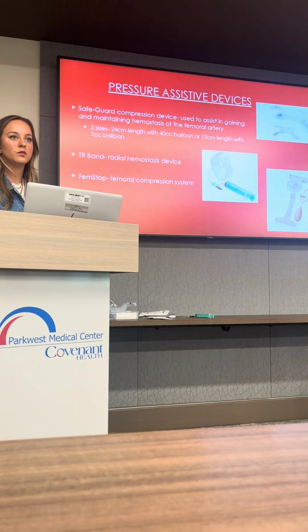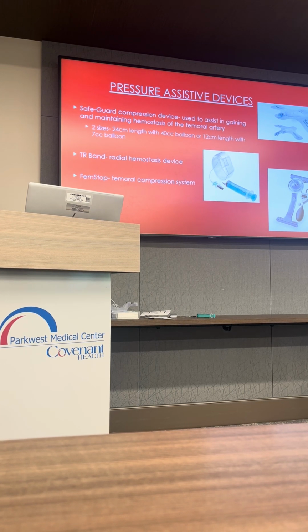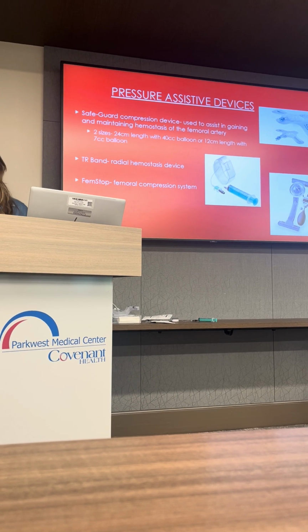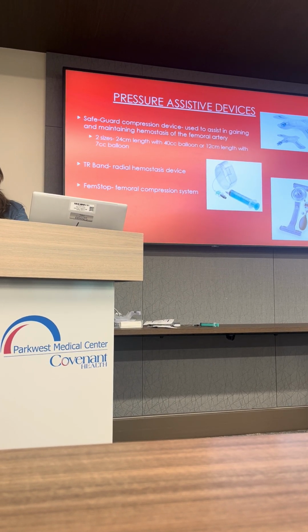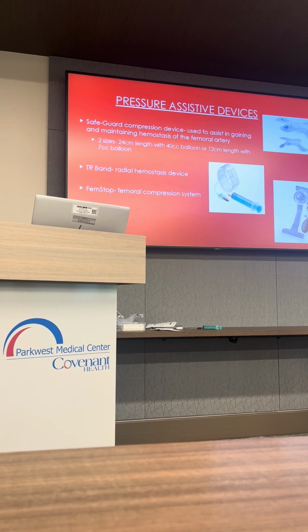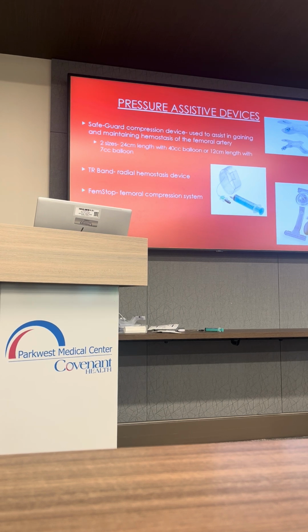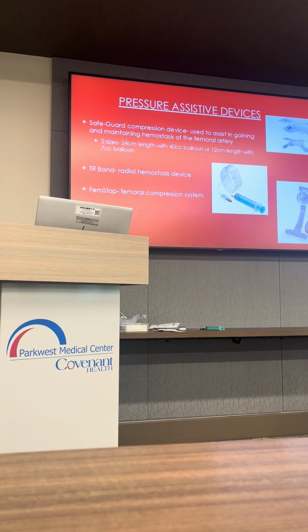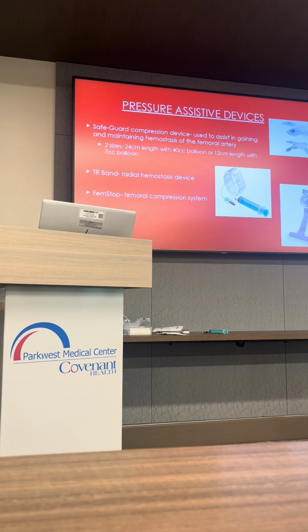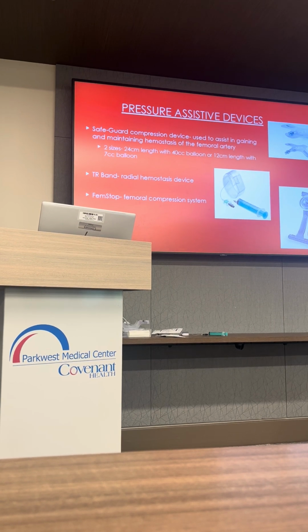Especially with an RP, that's the one time you need to ask, and physicians should say this. There's a repositionable sheath, and then there is a peel away sheath, and usually we will leave the peel away sheath in, which is a larger sheath. The problem with the peel away sheath is that you can fracture it and crack it, and if that happens, they'll bleed like an RP type bleed. So you basically have to immobilize those patients. It's fine if it's just overnight, but you definitely want to be careful with a femstop. Yeah, you make the leg ischemic. That's the biggest risk. If you leave a femstop on for too long, the leg will get ischemic.